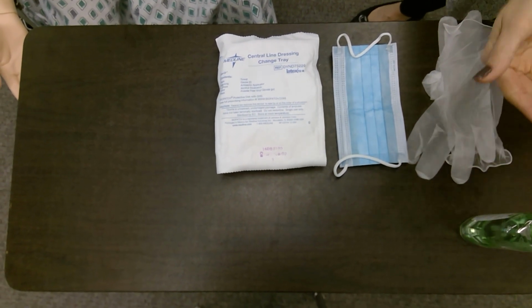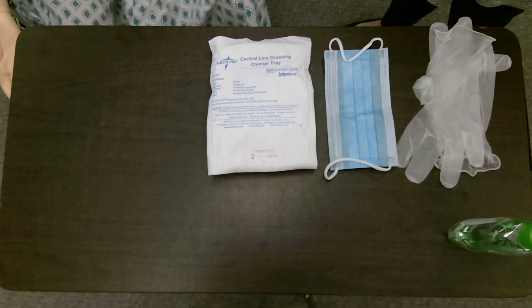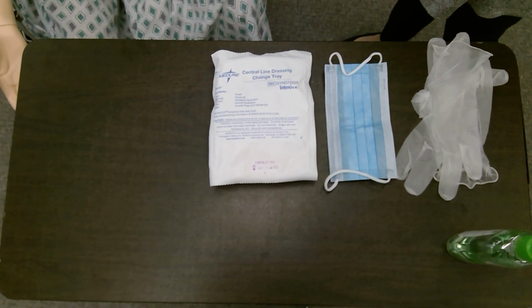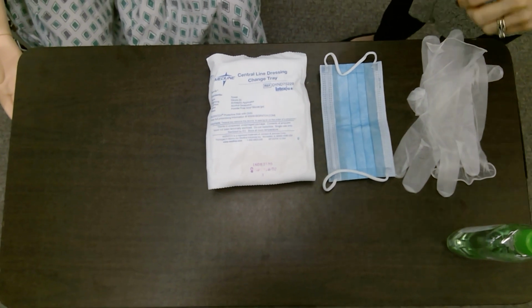Okay, Sarah, now that we've drawn that blood and sent it down to the lab, it's time to change the dressing on your PICC line. Is that okay? Yeah, it is kind of loose, so I think we do need to change it.